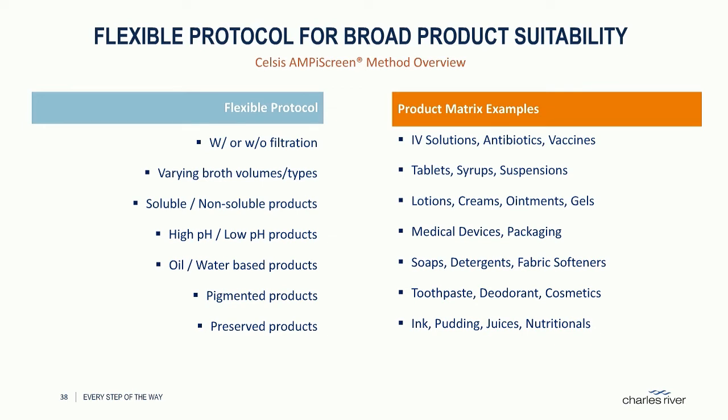And so to give more specific examples, things that would be more respective of pharma would be IV solutions, antibiotics, vaccines, even things that are tablets, suspensions, lotions, ointments, some of these medical devices.